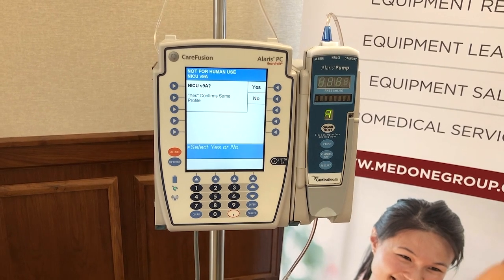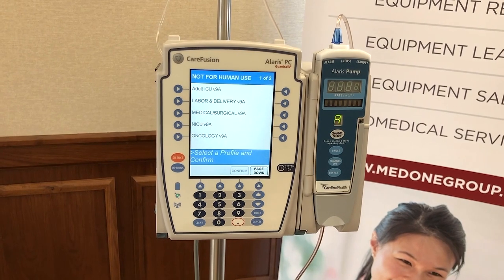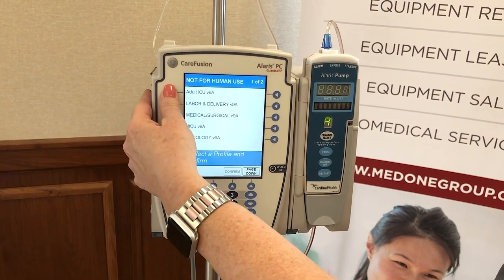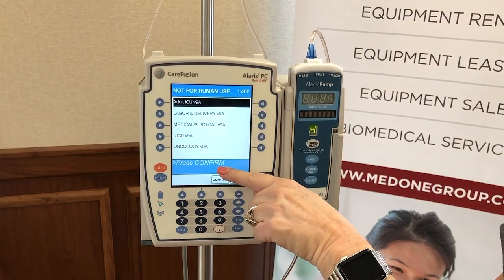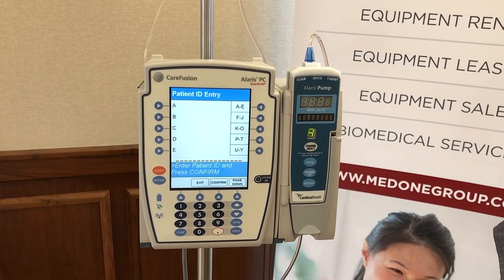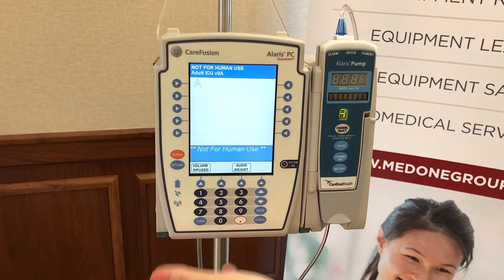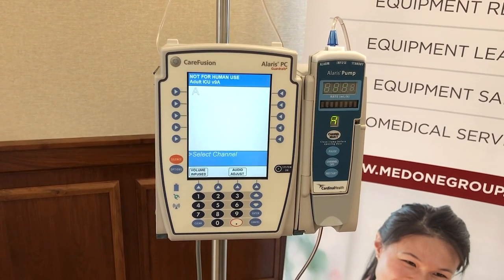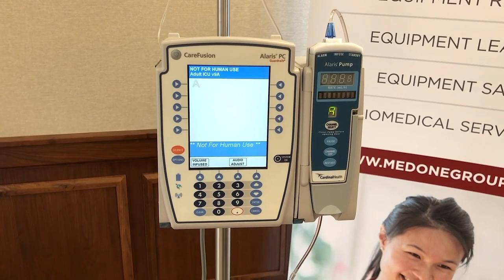We're going to say no to the one it was last used in and choose the adult ICU for this scenario. We'll go ahead and choose adult ICU, and if you'll notice the blue bar at the bottom, it will always tell you what to do next. Now we're going to press confirm. The library of drugs for ICU will come to the forefront, and we'll bypass the patient ID screen — just press enter to confirm and move past that.